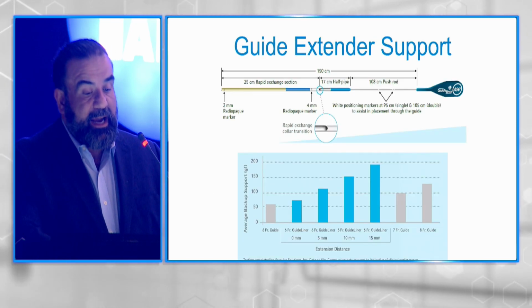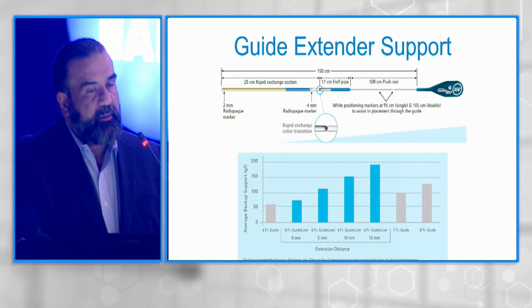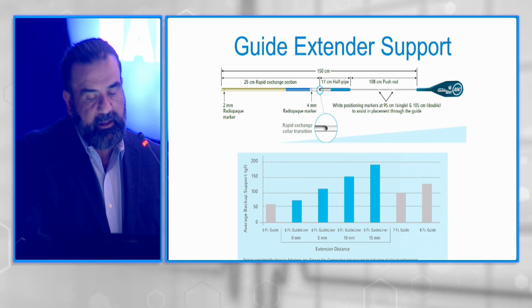This is what a typical guide extender looks like. Most of them have the same components and different, obviously, specifications.